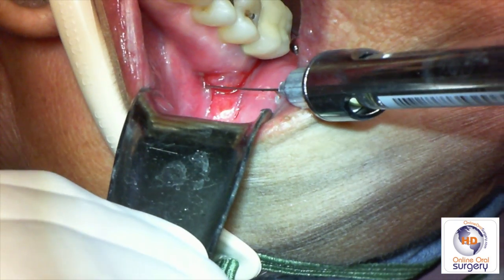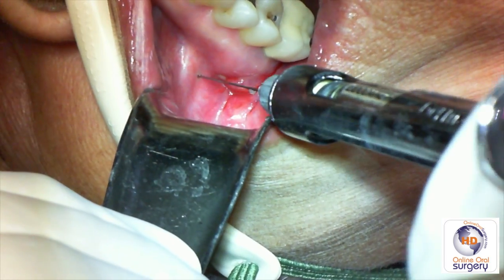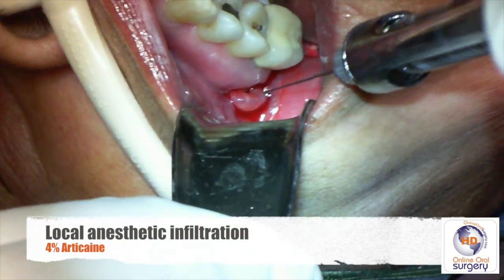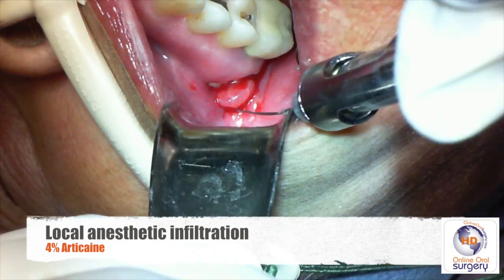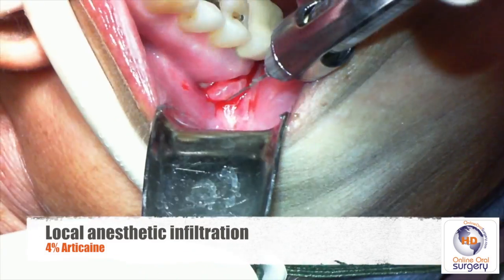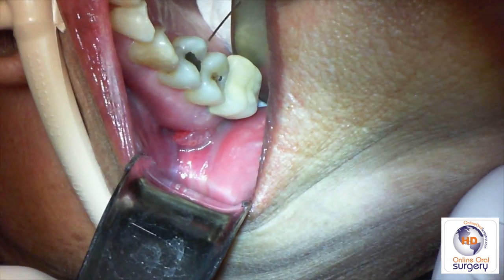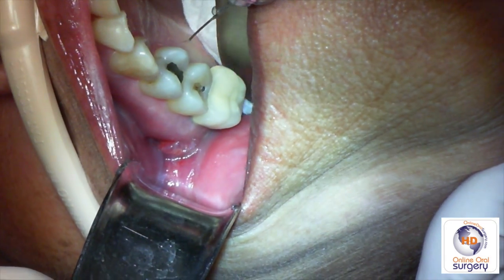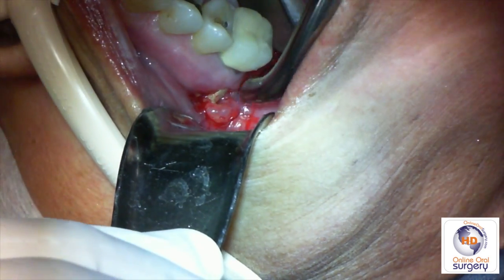We're going to start our procedure by giving some infiltration with a local anesthetic. My preferred local to use is 4% articaine — it penetrates very well and gives profound local anesthesia. I'm going to infiltrate around the tuberosity area on the buccal and on the palatal, carrying that to about the second premolar region.